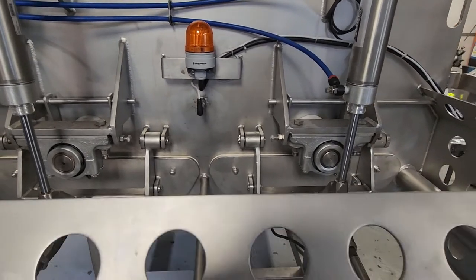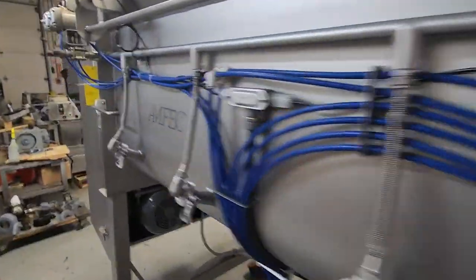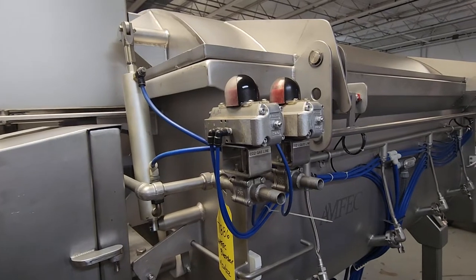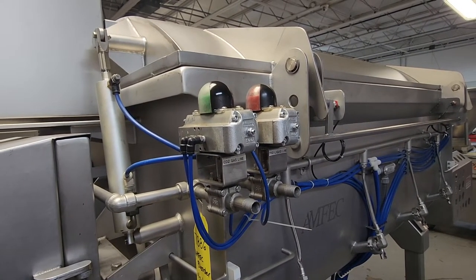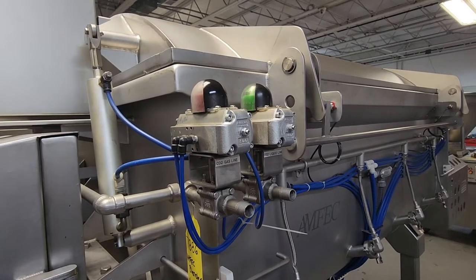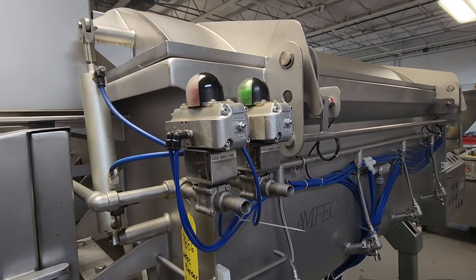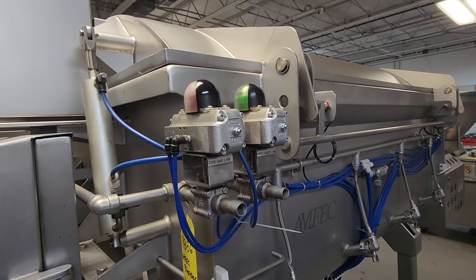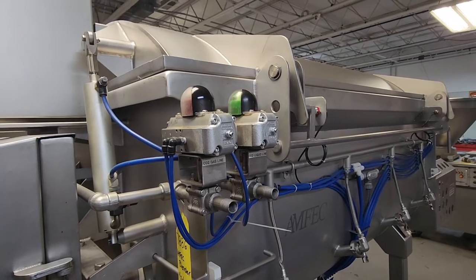I'm going to go over so we can show the CO2 valves open and close. Show me the CO2 valves please. So that's the purge, and now it's the gas. And then end the cycle so we can show the purge again.